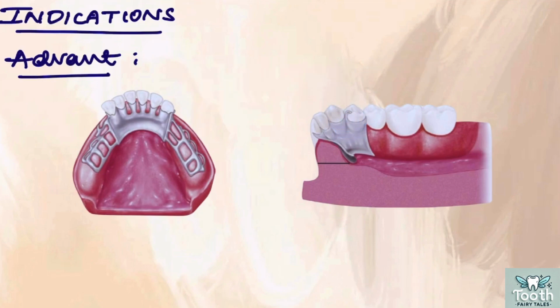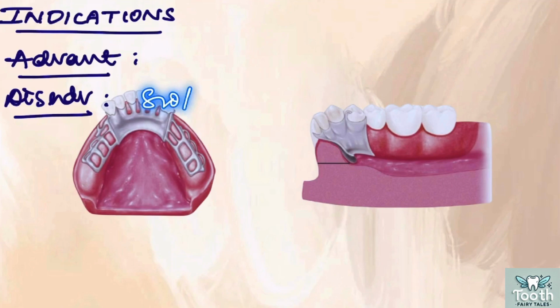What are the disadvantages of this lingual plate? There is a chance for soft tissue irritation, and extensive coverage of the teeth can cause decalcification in future.